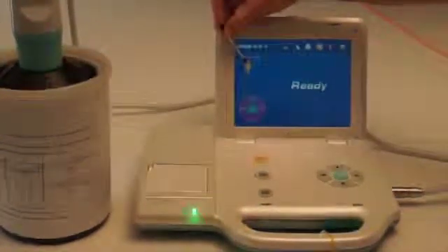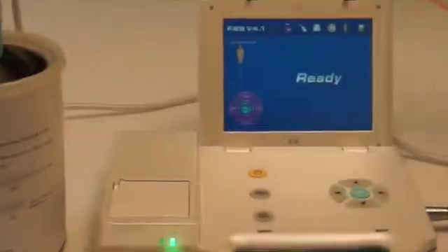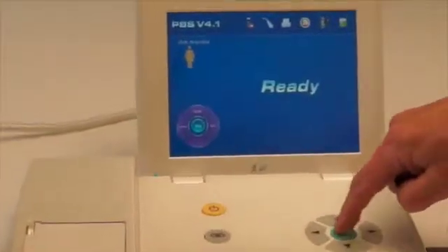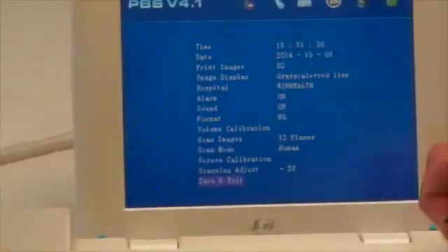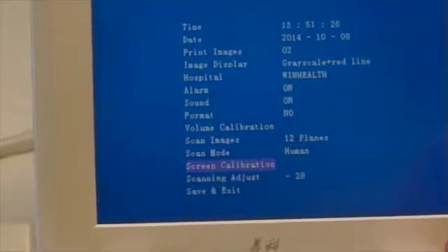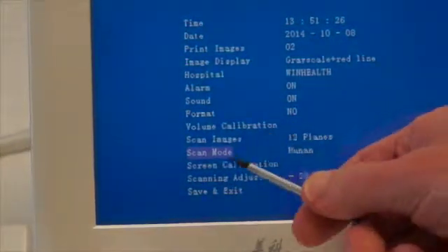When you turn the bladder scanner on, you'll see at first that it's set for Human, which is the first screen that comes up. What we need to do is change the Scan Mode from Human into Phantom.